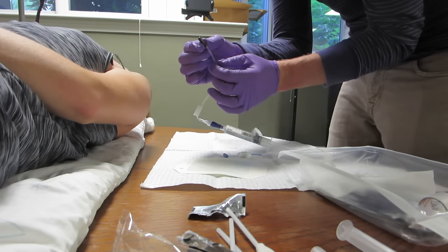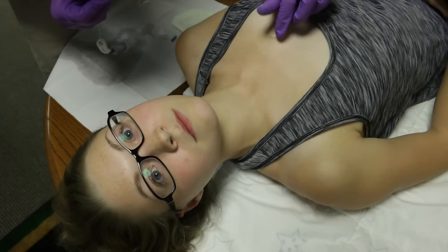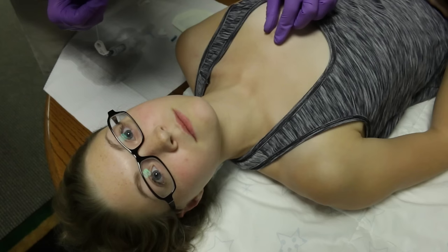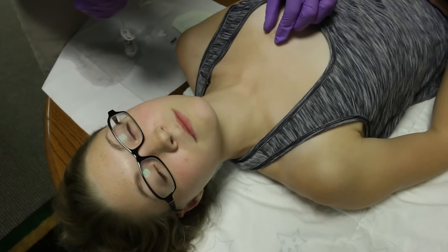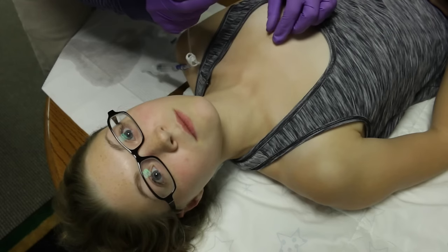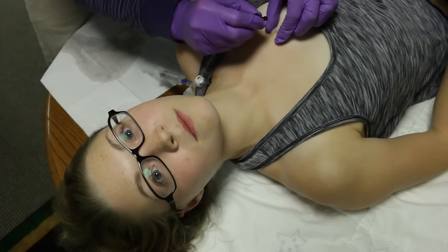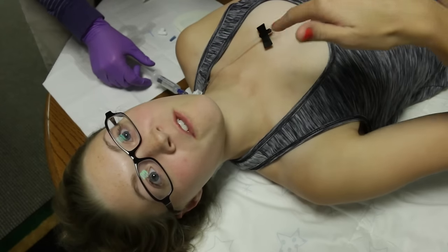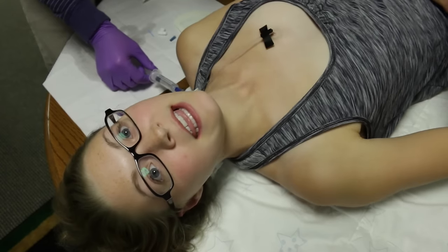With this needle, hold the two wings and come to the port. Stretch the skin across the port and grab the port securely. Now that it's secure, in one fell swoop put the needle in. I barely felt it. If the syringe falls somewhere non-sterile like on a shirt, the patient would handle the syringe — but since it's still on the sterile dressing, the accessor can manage it. Unclamp and proceed.